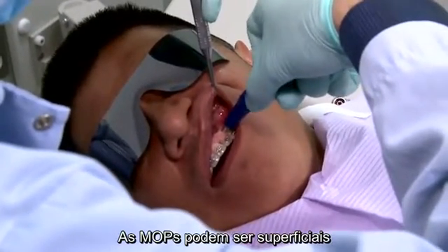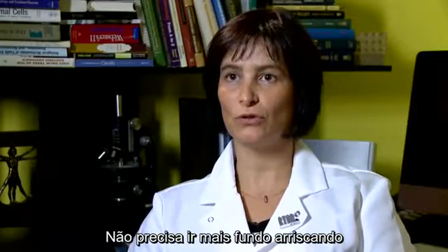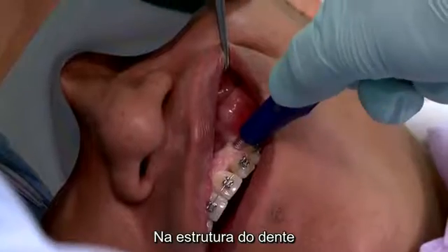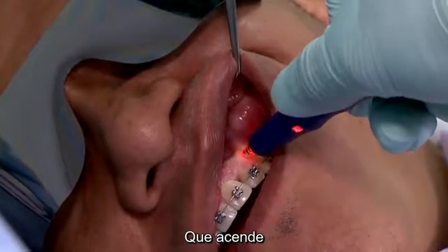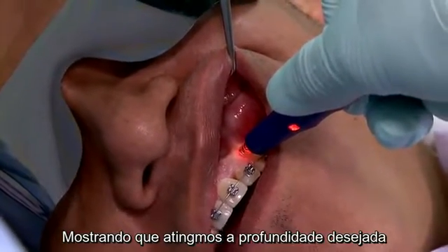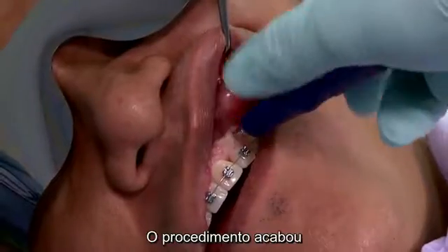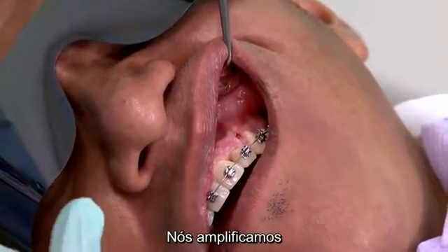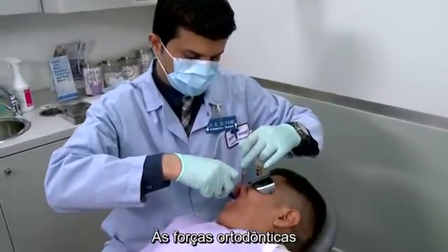The osteoperforations can be superficial. We could perforate the cortical plate, but you don't need to go so deep as to risk damaging any tooth structure. The appliance has a light detector. As soon as you reach that depth, it turns on. That shows that you achieved the goal that you wanted. You take it back, and now the procedure is over. In total, it should not take more than 30 seconds to 1 minute. We're amplifying the patient's response to the orthodontic forces.